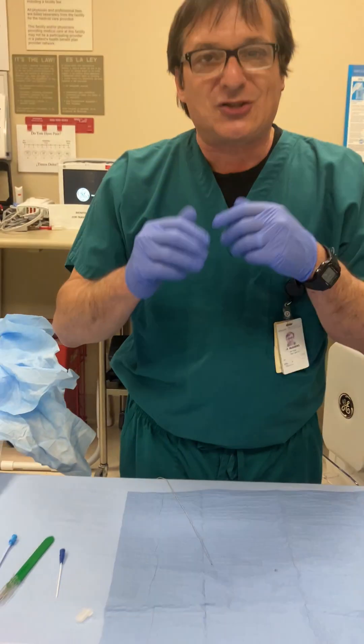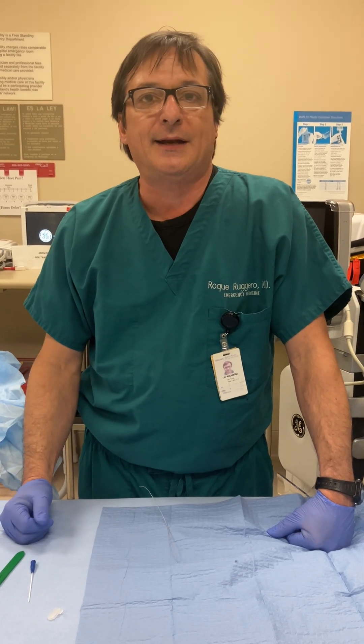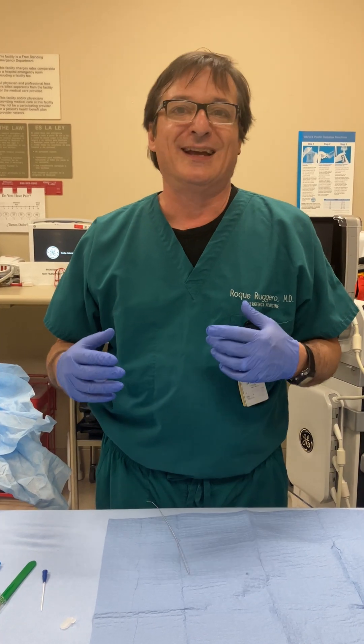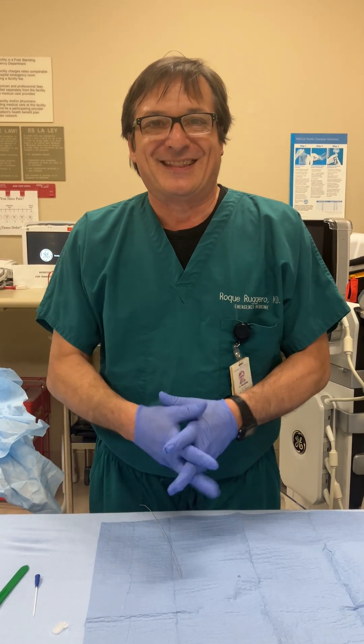That is a quick tutorial on how to place a central line. Obviously there are many more details you need to be familiar with, including indications and contraindications, but this is just a general overview. Thank you.